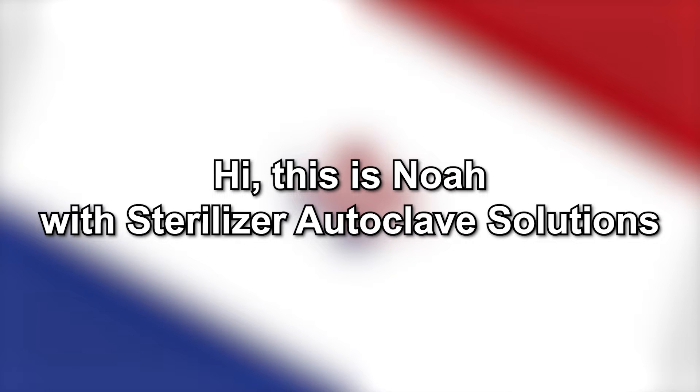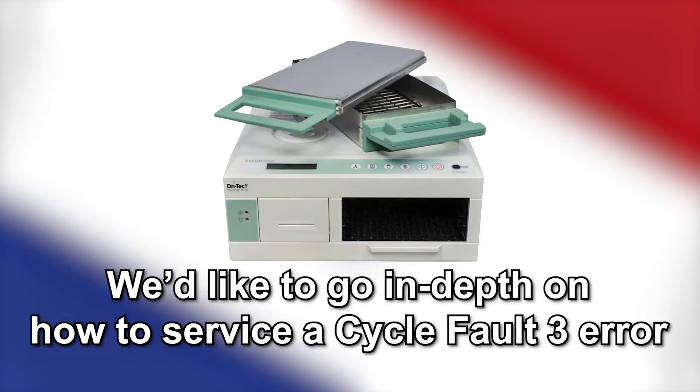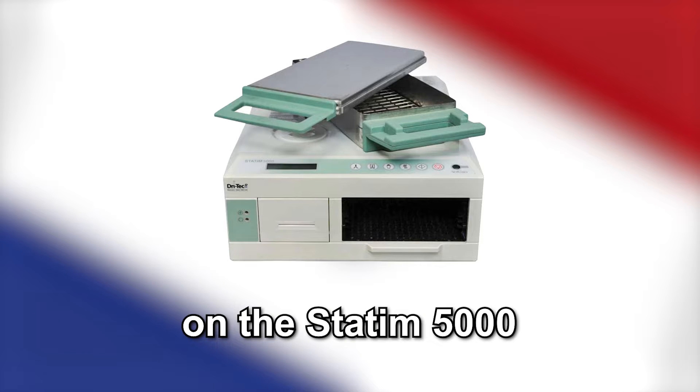Hi, this is Noah with Sterilizer Autoclave Solutions. In this video, we'd like to go in-depth on how to service a cycle fault 3 error on the Statum 5000.